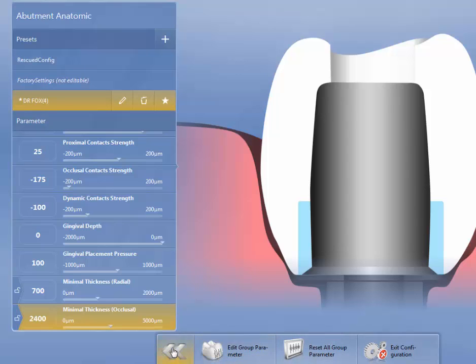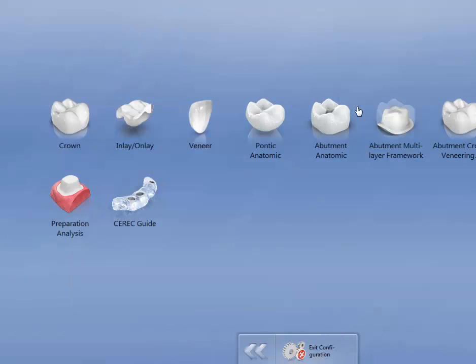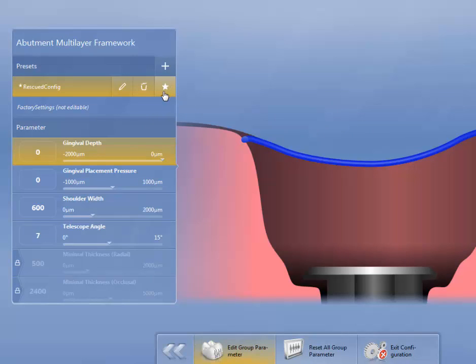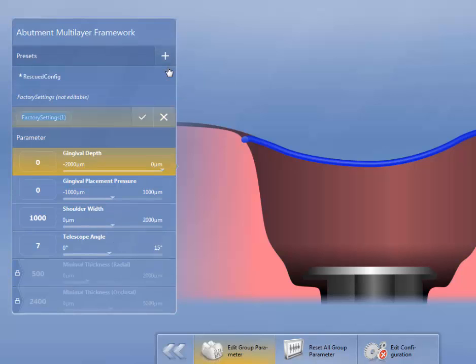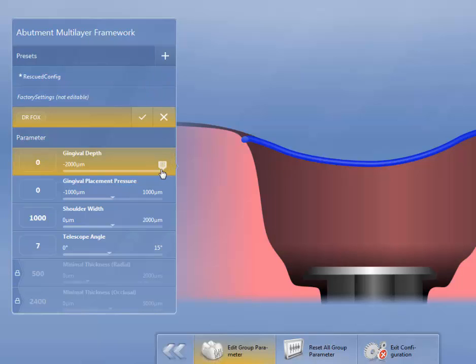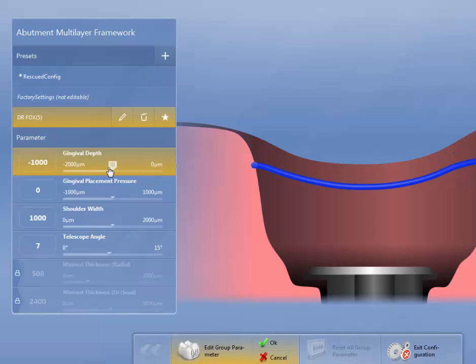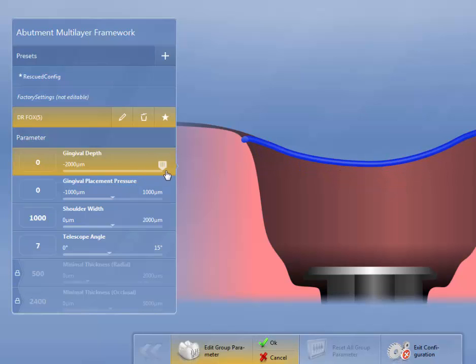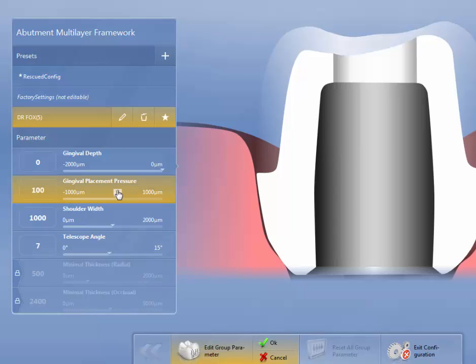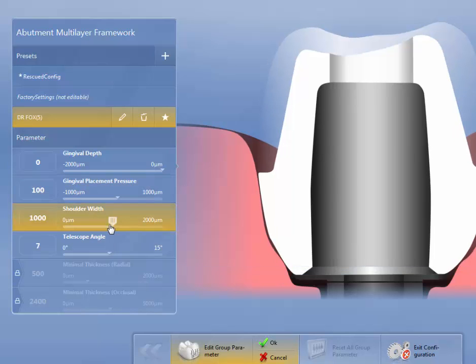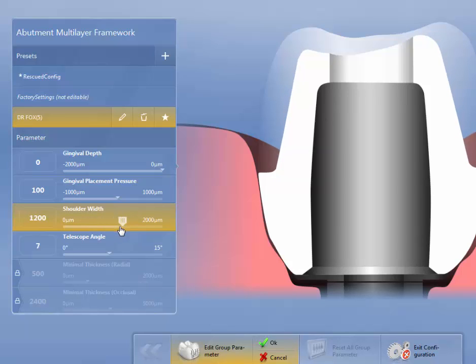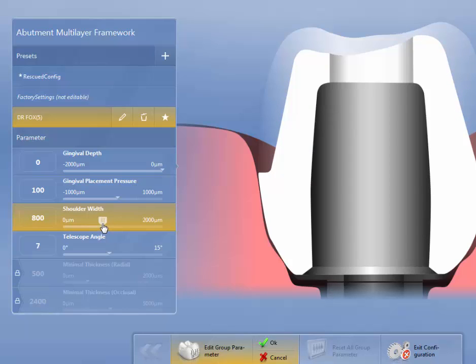Then I'm going to go backwards, and we're going to do Abutment Multilayer Framework. This is the framework underneath. And again, I'm going to add presets. And then for my gingival depth, I personally like this set at zero. I don't like to go below the gingival tissues. Gingival placement pressure, I'm going to put 100 microns. Shoulder width, I'm going to go down to about 600. The wider you get, the little bit more difficult it is to match these, so I'm going to go to 800.